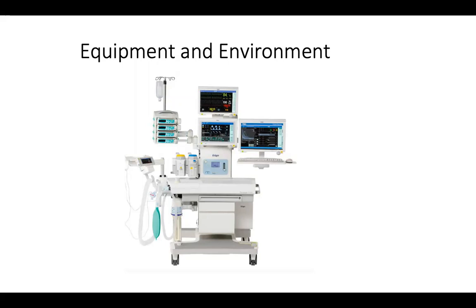Most anesthetic machines are able to ventilate patients between 45 minutes to 1 hour without a power supply, just battery powered. So that will give you enough time, if you've given a muscle relaxant, for the muscle relaxant to wear off and for you to think of another plan to ventilate that patient. So your machine must always be plugged. You must have a backup oxygen, and you must have an ambu bag, always, always.